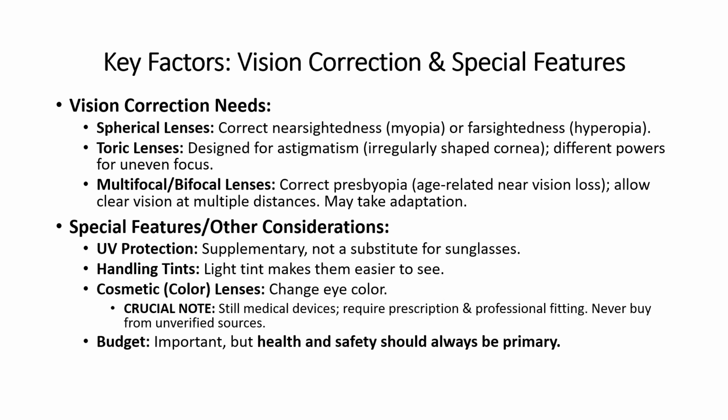Here's a crucial note: cosmetic contact lenses, even if non-corrective, are still medical devices and require a prescription and professional fitting to ensure safety and proper fit. Never buy them from unverified sources. Lastly, while budget is a factor, it should never be the primary driver. The healthiest and safest option for your eyes should always take precedence.